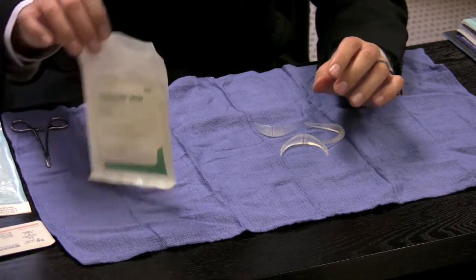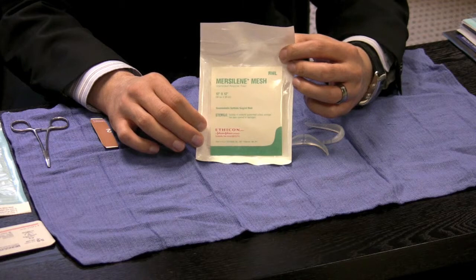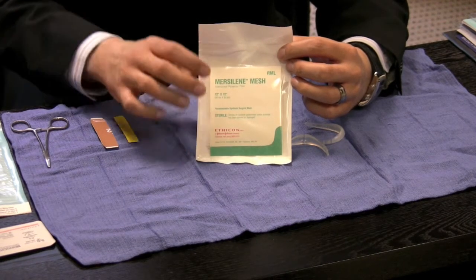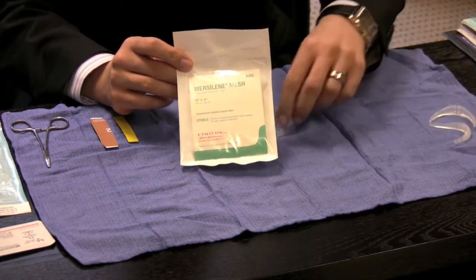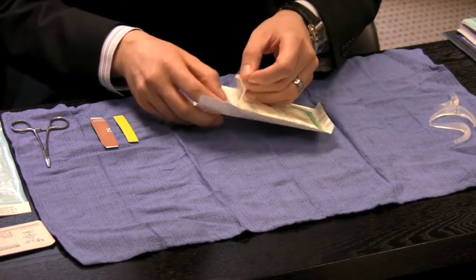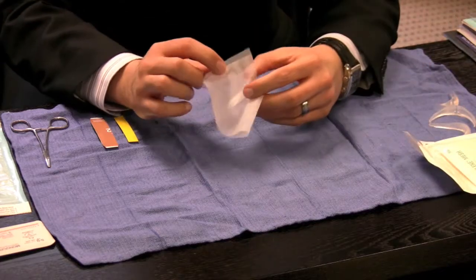And when I make my own chin implants, I use a material called Mersilene Mesh. This is surgical mesh. It's a very soft cloth, and you'll be able to see exactly what I'm going to do with it today. So what we do to start with is take a package. It comes in a 12 by 12 inch package, and I open it up, and I've opened this one before, and this is the material.